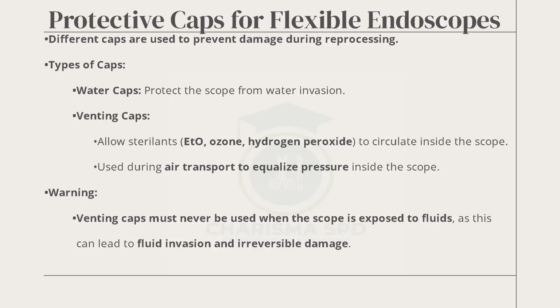All right. But remember that when you are cleaning it at decontam, you must not put the cap on, because when you put the cap on, you have opened the channels for water to go in. So we don't use the cap in decontam, but we use the cap when we are assembling. All of that information will better serve you when you are on the job.